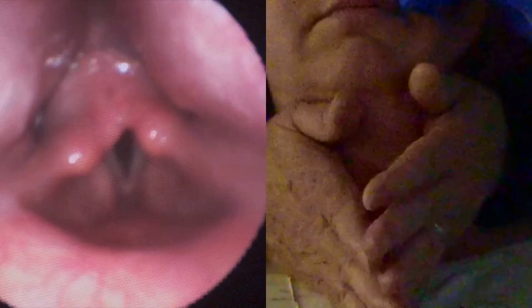So interesting to me, I don't know if you guys see it too, but even though she says it doesn't feel impactful, it's not completely symmetric, but there's more synchronous movement between her arytenoids when I do that, or when I took the pressure away? Very much so. When you had it anchored, when she was having that anchored feeling. E, e, e. Can you do a glide up? E. Do you find that challenging because I'm resisting that? Yes. When we do this anchoring later today, most of you will feel it a lot more pronounced with swallowing than you will with elevated pitch, okay? It's the same concept, but you can overcome it more with the pitch glide than you can with the swallow.